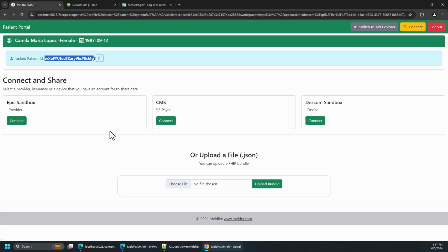Now, what we want to do in here is we are not going to go through the flow, because we want to focus on how the data is loaded from here. In the case of a CGM device, typically that data will not be in a FHIR format. So we obviously need some way to convert that data into a FHIR format. The app that is uploading it, whether it is the app from the device or an app built specifically for that uploading purpose, can do that.